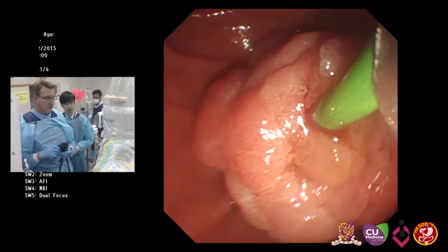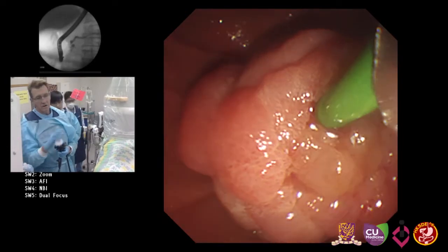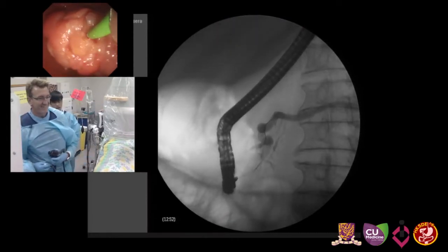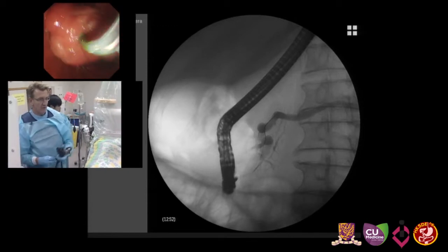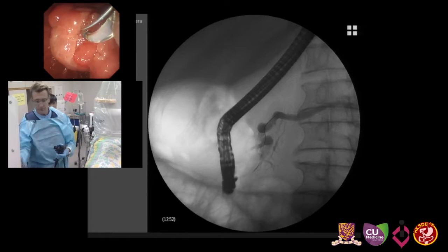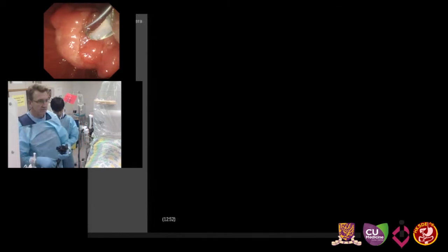Thank you. Okay, so can you see the ERCP image? Please enlarge the ERCP image a little bit. Yeah. Fluoroscopy, bigger, please. We've changed his position. In the brief time you were away, we've moved him to the prone position. And so now we actually have a better appreciation of the adenoma as well. And it doesn't look, I have to say, as daunting. So we've outlined the pancreas, which is dilated to the level of the papilla. So this will be fine to remove.